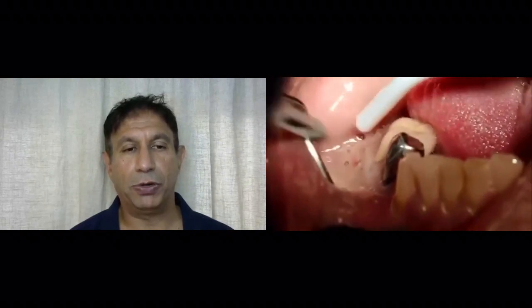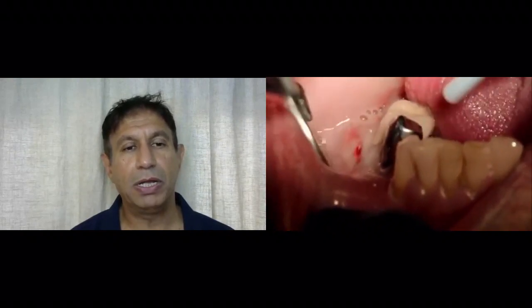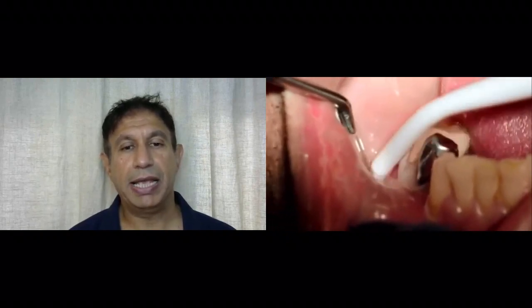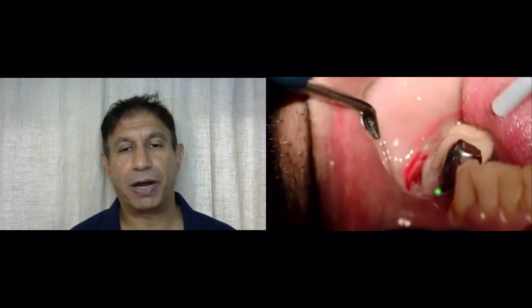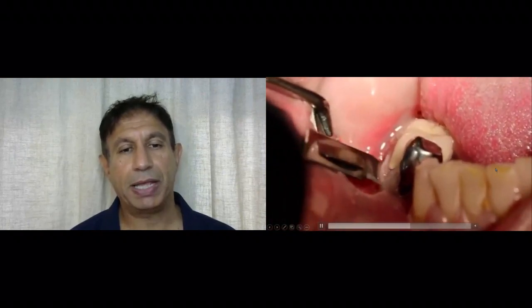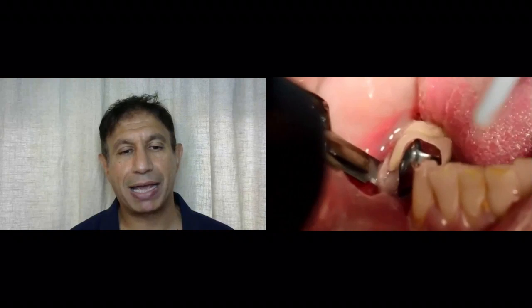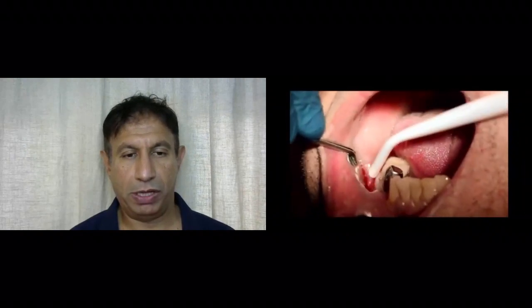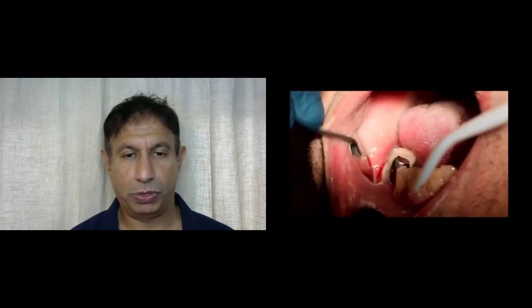You will notice that the knife is turned around, the blade faces anteriorly, and as it is put in, the incision goes from back to front and not from front to back. So you're putting your blade in and the incision is going from back to front, allowing you to go all the way down to the bone, where the maximum amount of pus is collected with these teeth. So, getting all the pus out from that tooth.